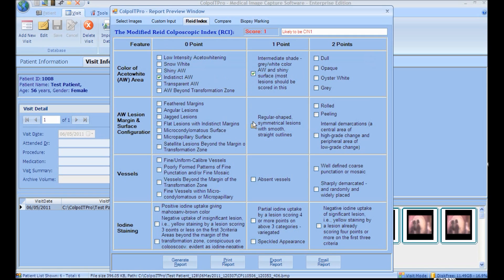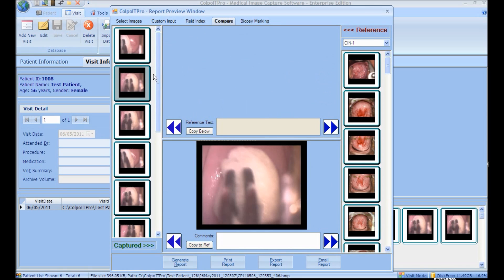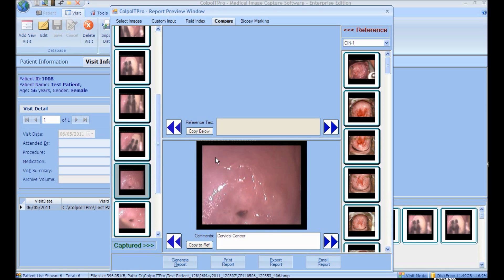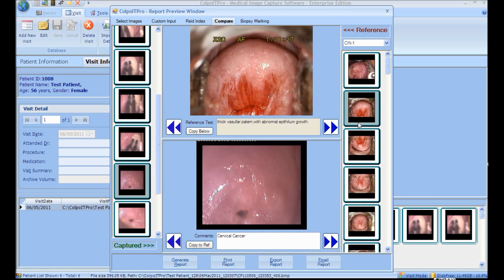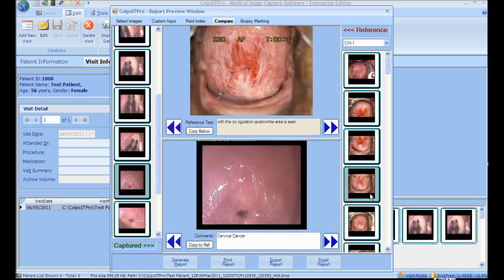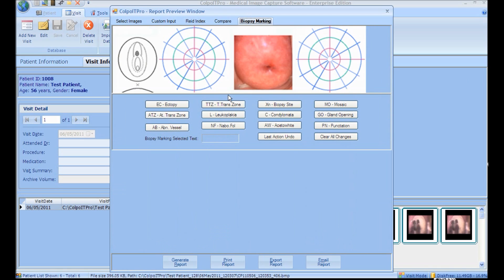Read Index: it helps in selecting possibilities to determine the severity of the disease and generates a corresponding score. Compare: Colpo IT Pro has an inbuilt standard image comparison feature that helps compare the captured image with standard images. Biopsy Marking: it helps in marking text on the biopsy chart. Select the text, place the cursor on the desired location, and click — the text appears on the biopsy chart.